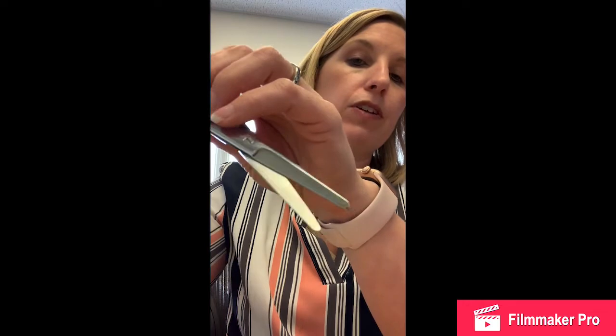And speaking of not using them for suture, these are heavy scissors or suture scissors. You can use these to cut not only suture, but you need to cut drains shorter, things like that, mesh in the abdominal wall, as long as it's safe. These are going to be your real, like, heavy-duty, cut-through-anything kind of scissors.